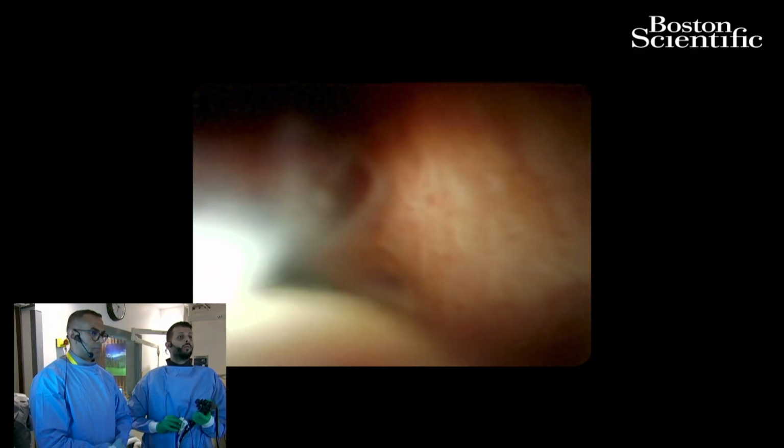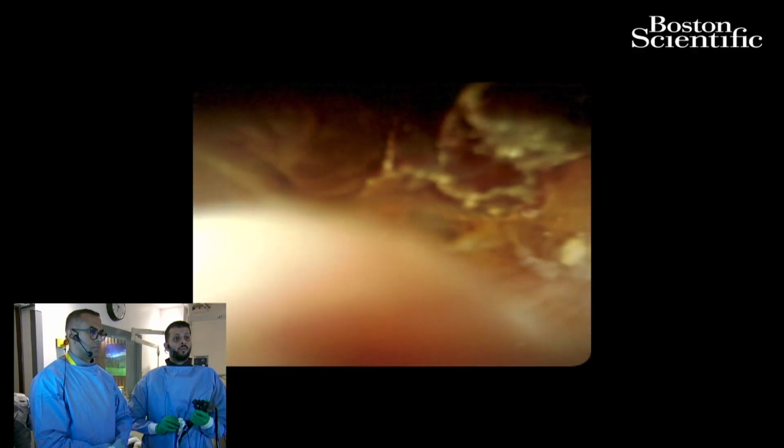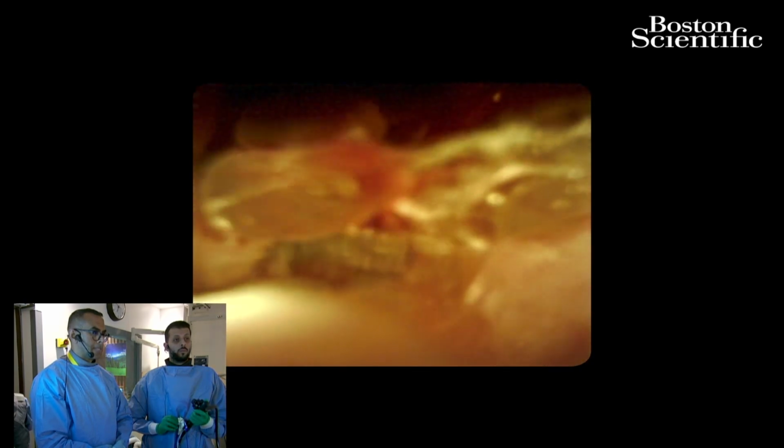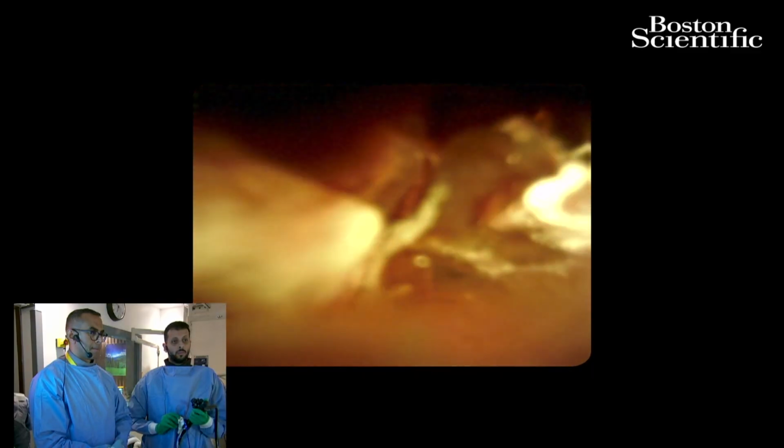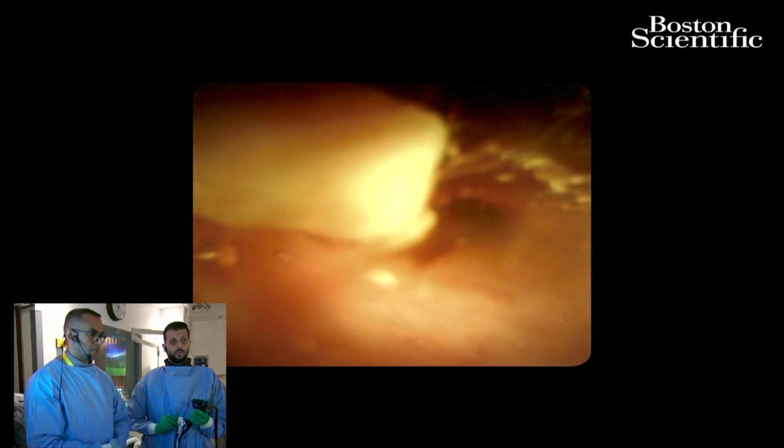Okay, so the plastic stent... and his cholecystectomy was 25 years ago. No, but the plastic stent was, oh, when? Just a few weeks ago. The problem, Sam, as you said, is that the cholecystectomy is very old.